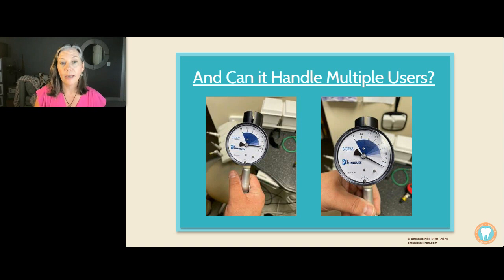So it was okay, right? But then when I turned on my co-hygienist's HVE, so I had mine on and she had hers on, oh my gosh, we bottomed out at like 5. So our vacuum system is not set up for all of us to be using HVE. And come COVID, all of a sudden we're all using the HVE. So it's really important that we take care of our vacuum. We'll get back to that. Robbie gave us lots of hints, and I'll tell you all the good tricks.